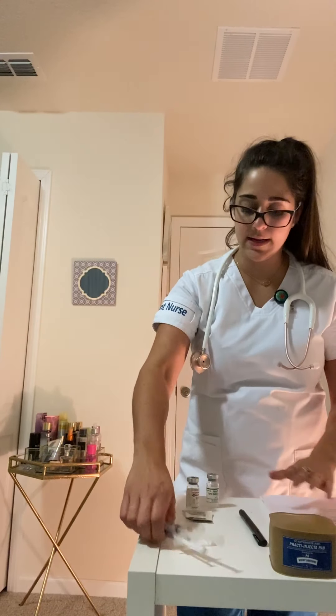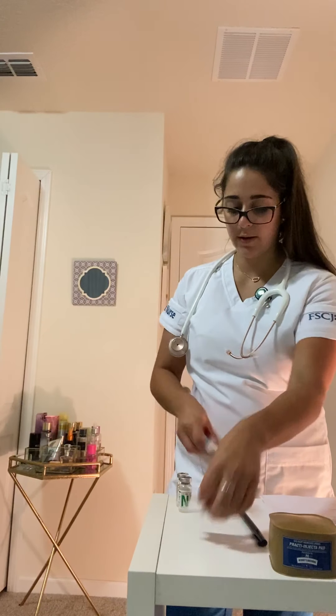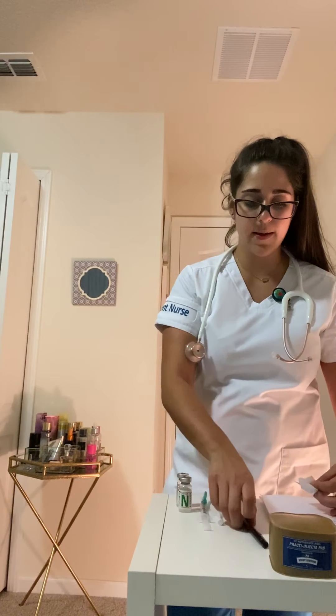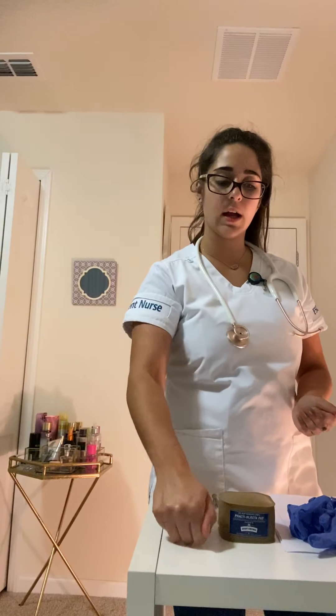I'm going to make sure I have my needles, my vials, alcohol swabs, gauze, and my gloves. And I'm going to go take this to my patient's room and knock. My name is Julia. I'm going to be your nurse today, and I'm going to be administering your injections.